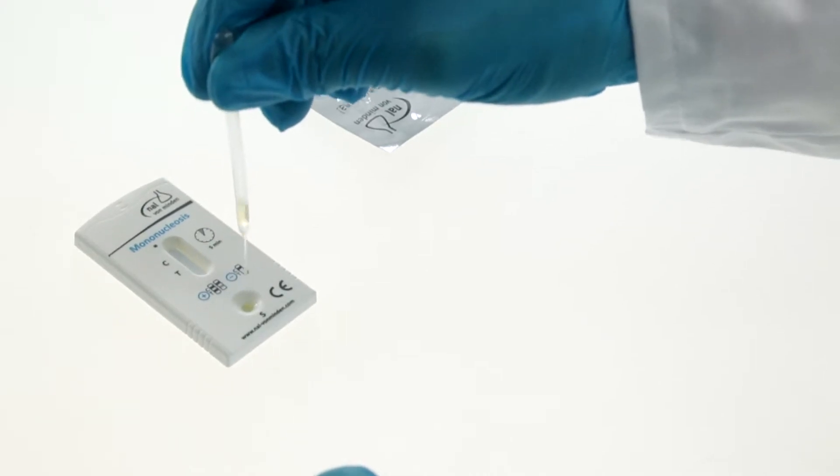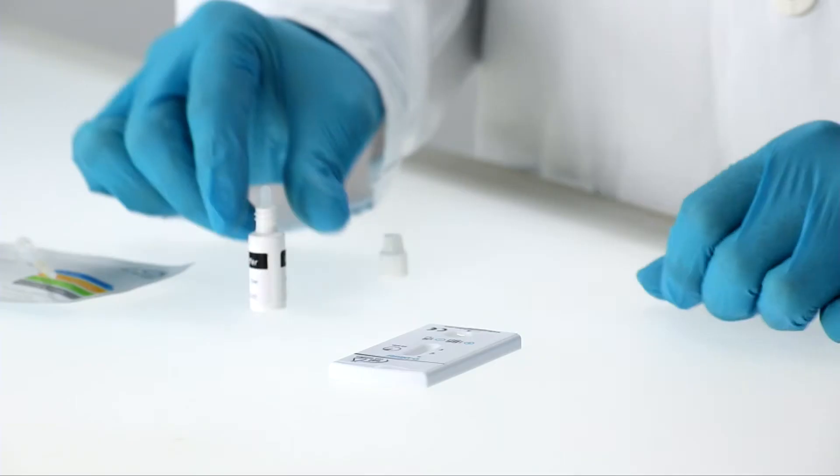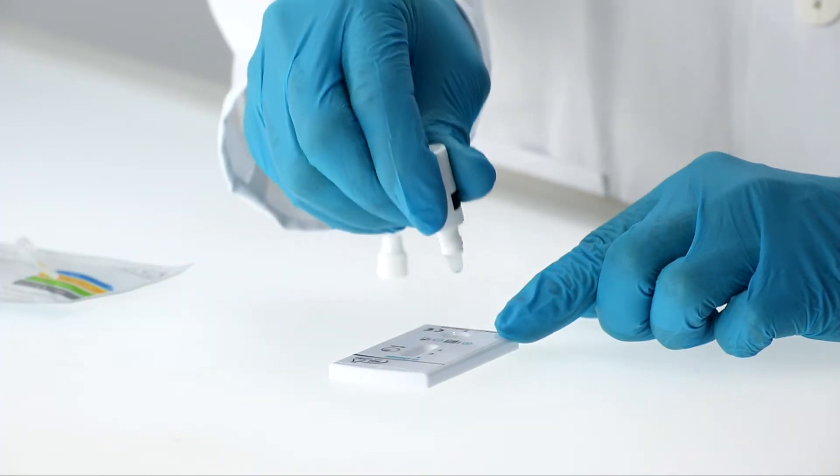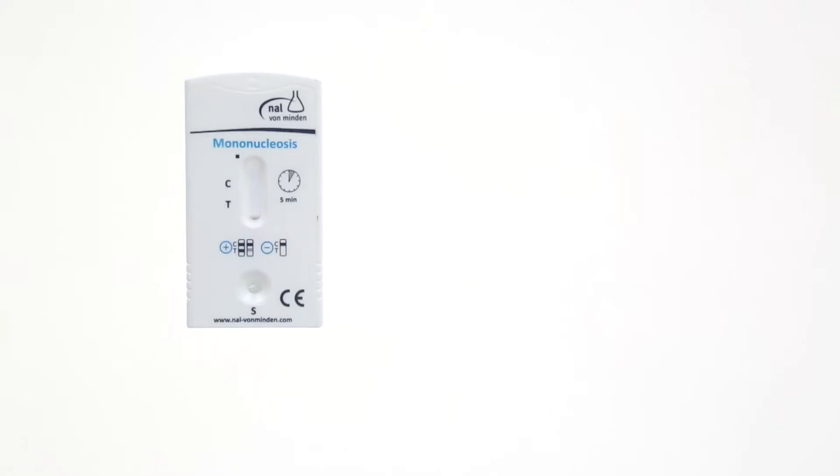Holding the pipette provided vertically, dispense one drop of serum to the sample well of the test cassette, then add one drop of buffer. Read the result after five minutes.